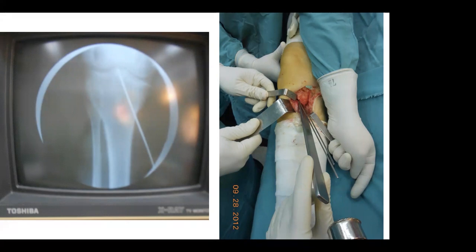I think in this situation, I use a similar technique, medial side, and I'll use a distractor to unload that area to make sure that it's easy to open up and make the correction. The other thing I think is that I'm particularly delicate with regard to the posterior aspect. Obviously, the neurovascular bundle is back there, and so I use a Kerrison rongeur and really work under direct visualization and am particularly careful back there.